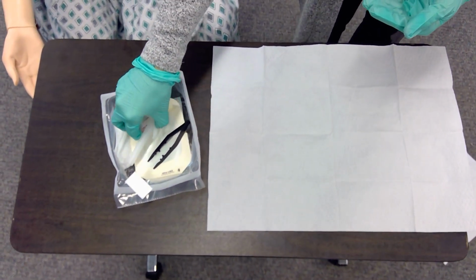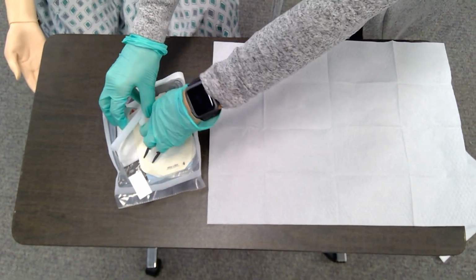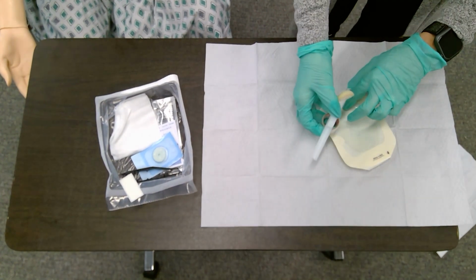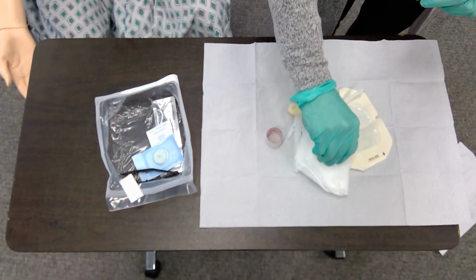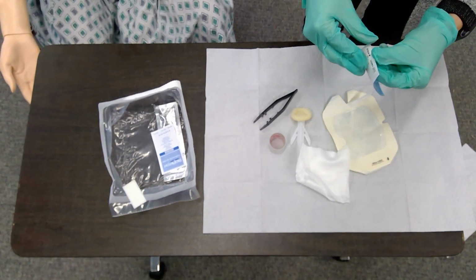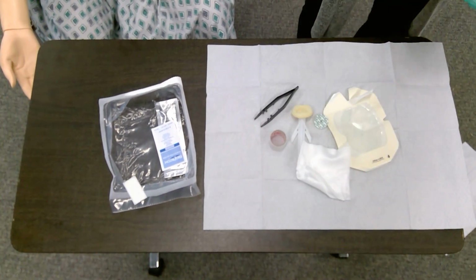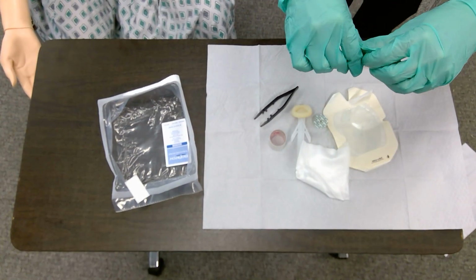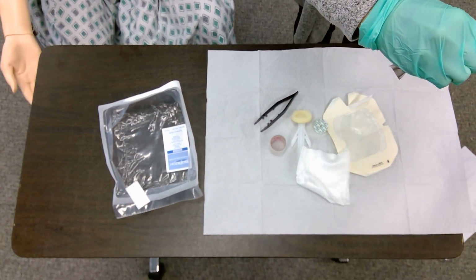And I'm just going to transfer all of this stuff over to my sterile field. Don't get too close to your 1-inch border margin. Go ahead and open up my bio patch so that it's ready when I need it. Just throw that away. I'll go ahead and open up my alcohol swab also so that it's ready when I need it.